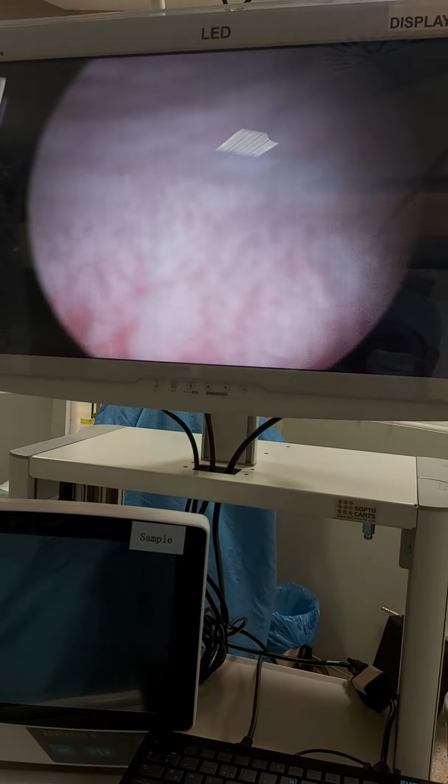Those ladies had many cystoscopies, and urology doctors do not accept these tissues as abnormal. They accept this to be trigonitis, and they say it is treatable with antibiotics. But for sure, this lady used a lot of antibiotics and she didn't heal. So the bladder is normal, there are no interstitial cystitis findings. Now we will make fulguration of these tissues.